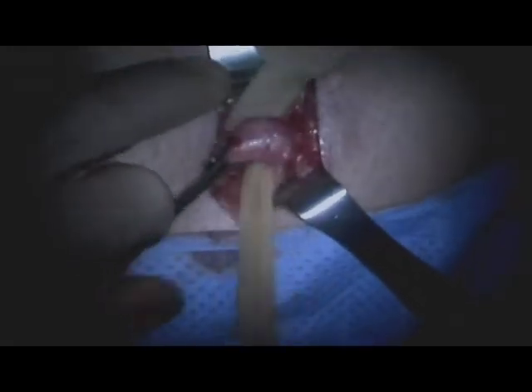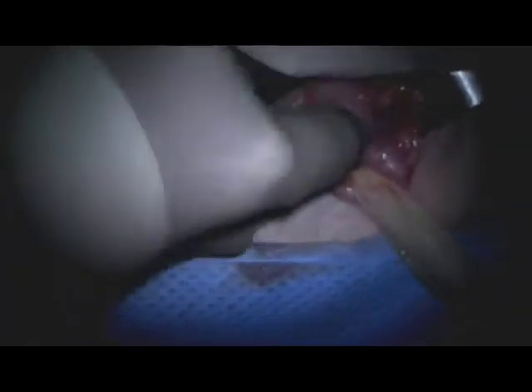A right angle clamp is then placed underneath the spermatic cord. A Penrose is then wrapped around the spermatic cord to allow for tensioning of the spermatic cord. The tissue underneath the spermatic cord is then evaluated for additional tissue that should be included in the denervation. The Penrose is replaced accordingly to include this tissue.